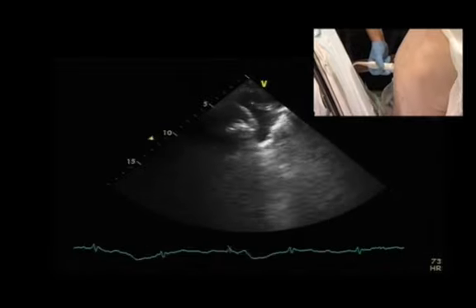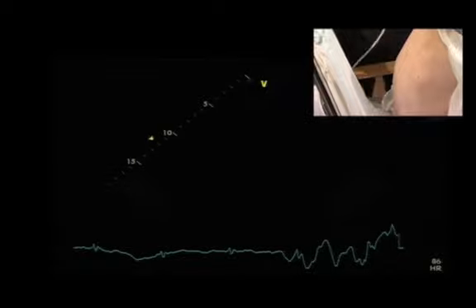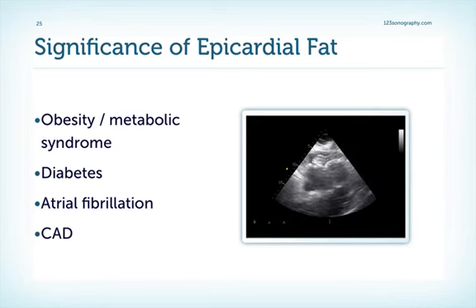The pleural effusion. So in our patient we have a pleural effusion both on the left and on the right side. And here's another differential diagnosis, epicardial fat. We can see the fat as it wobbles attached to the epicardium right here.